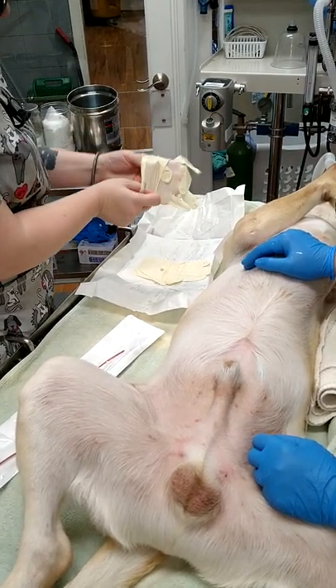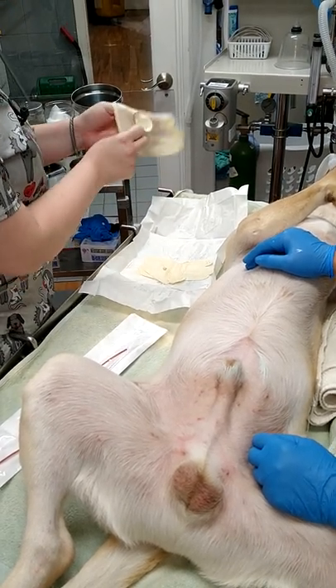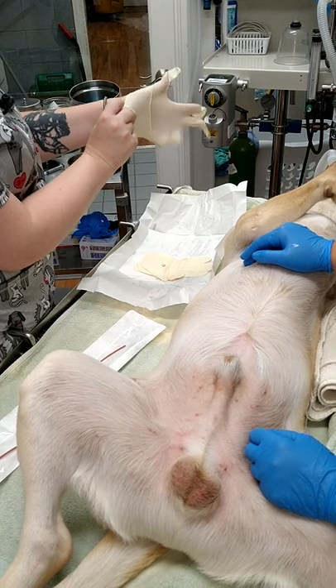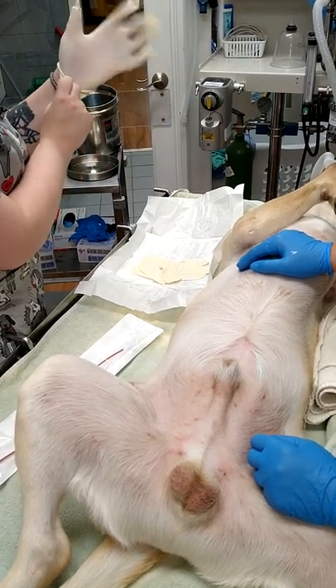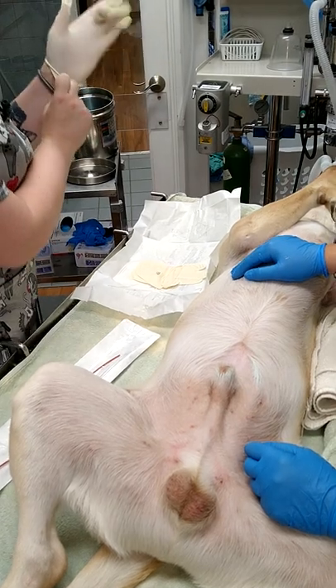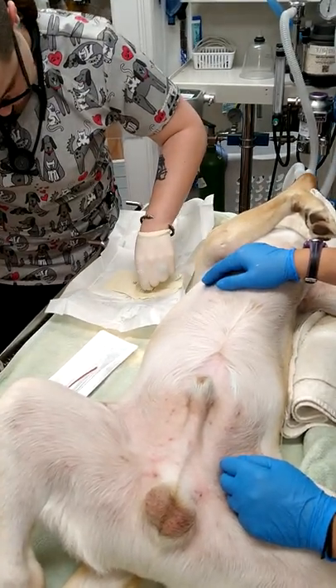You sure you're not a seven and a half? I feel like I was a seven, but you might want to. Here we go. As long as you've got your fingers in the holes, if you put your other glove on, then you can kind of roll your stuff down.